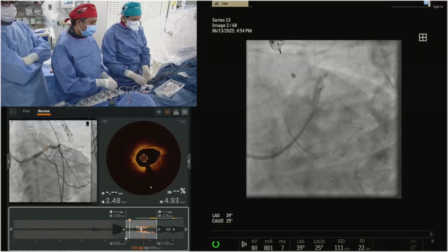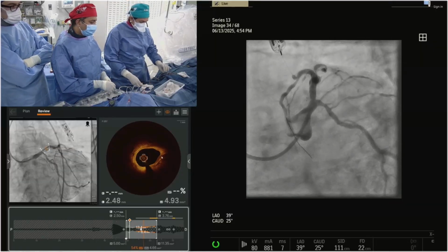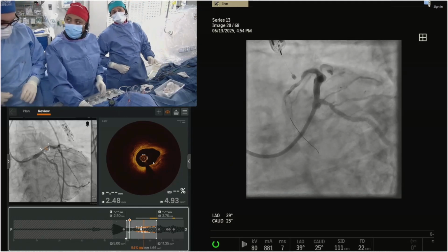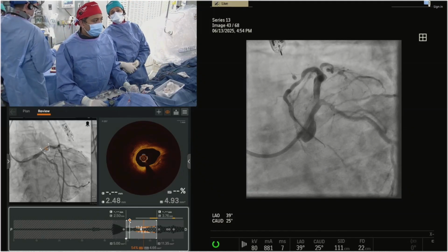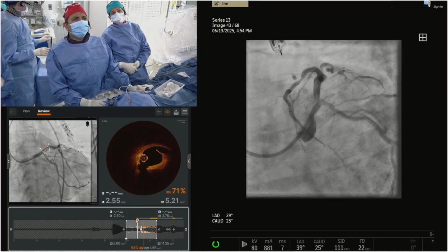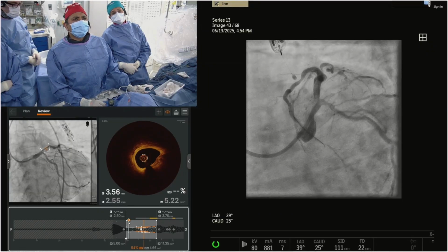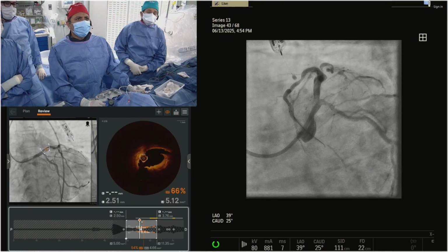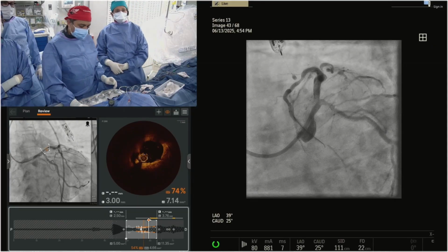So a little plaque, not lipid, calcium. I mean calcium. Yeah, a little calcium, but all these diffuse. How much was it? One quadrant? Yeah, one corner nodule. Again, the nodule, yeah, everywhere, but that we saw in angiography, the nodule. We suspected it. But it's a very illustrative case. Don't believe angiography, believe in imaging.